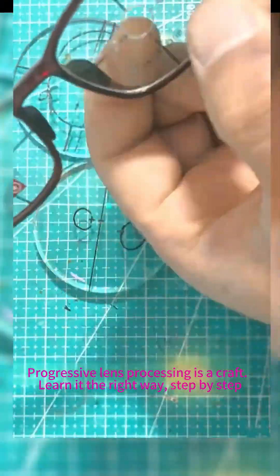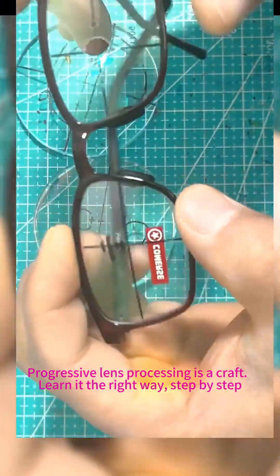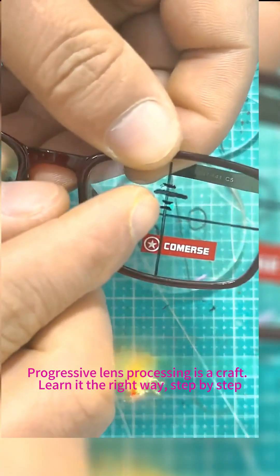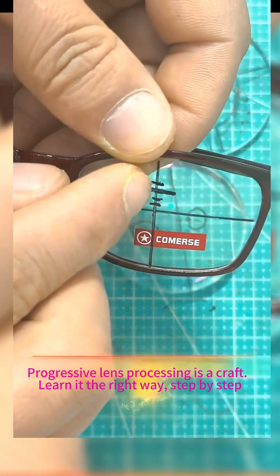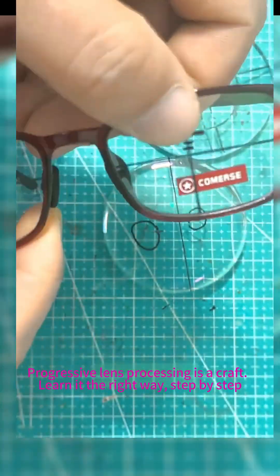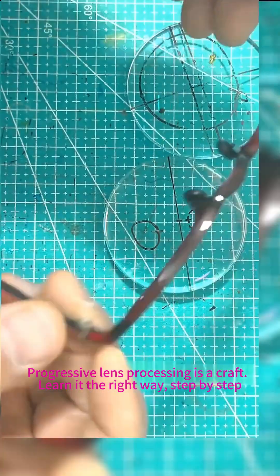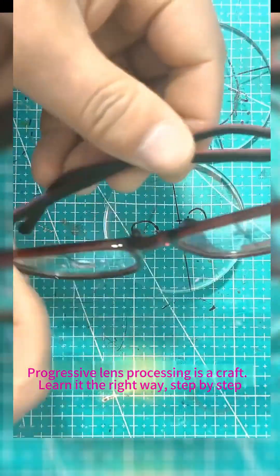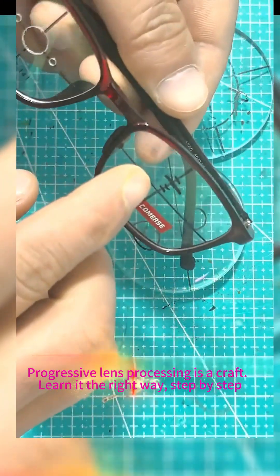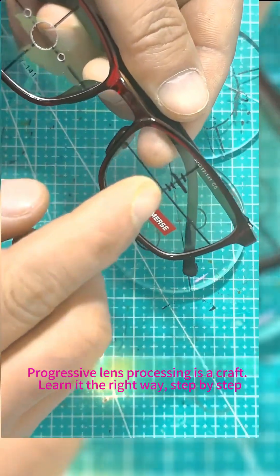Step 1: draw the geometric centerline. Mark millimeter scales along the bisecting line at 2-millimeter or 1-millimeter intervals — both work fine. Have the customer wear the marked lenses while sitting face-to-face, and observe which grid aligns with their pupils to determine the channel position.